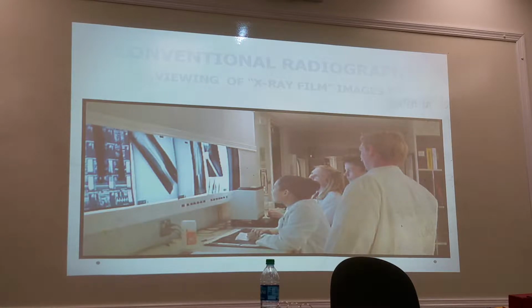So here is a DuPont cassette with screens mounted on the inside. These are the screens. This made the biggest difference in patient exposure. As I said before, you can greatly reduce. These are screens that take X-ray energy and convert it to light. And so it takes very little X-ray energy to produce a lot of light. So we were able to drastically cut down our X-ray exposure to the patient. Now the problem with the screens, anytime you involve light, and you're going to learn about this in digital, it's the same for here and it will be for digital.